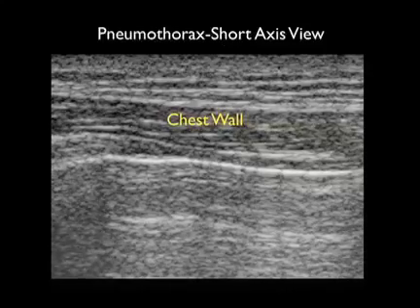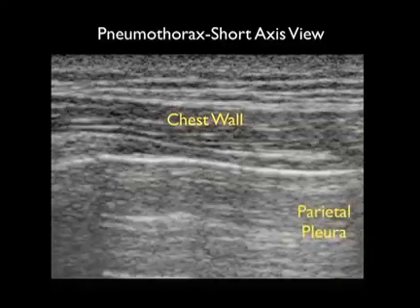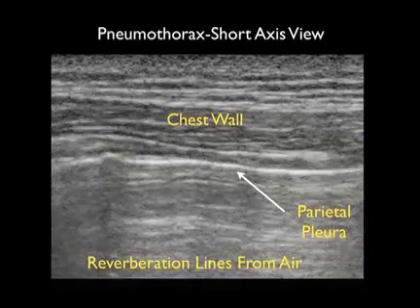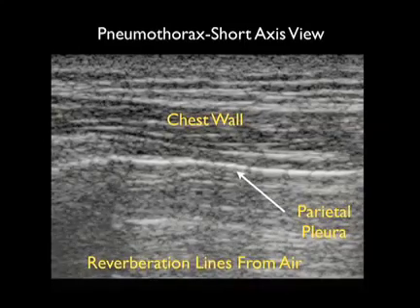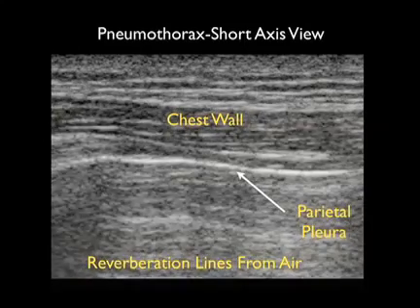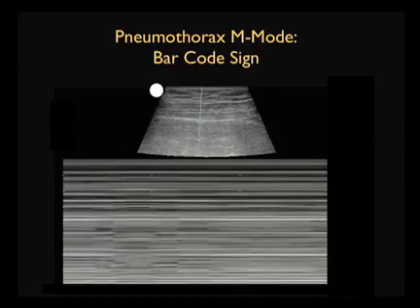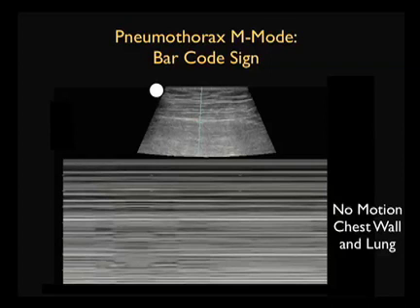Now let's inspect a pneumothorax from the short axis view. We see the chest wall anteriorly, the parietal pleura shown as a single non-mobile white line in the middle of the image. Note the failure of movement back and forth, the lack of vertical comet tails, and what we see here is repeating horizontal air lines from the pneumothorax. To document the absence of lung sliding and the presence of the pneumothorax, we'll again turn to M-mode. If we put the M-mode cursor down on the pleura, what we'll see is a set of linear repeating lines. This documents no motion of both the chest wall and of the lung, making up a finding known as the barcode sign.